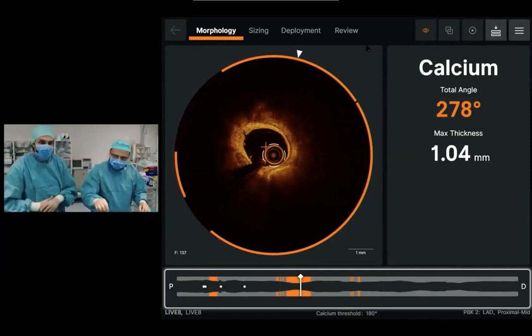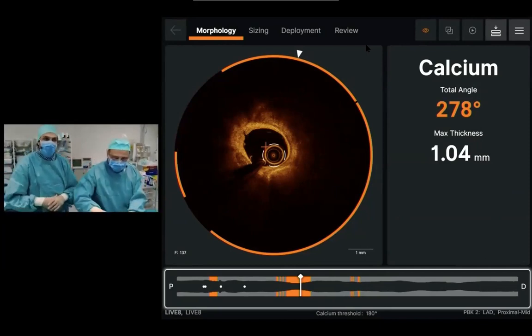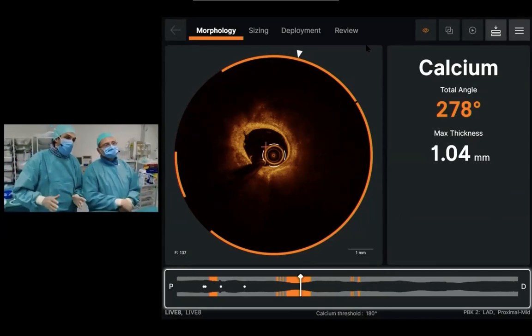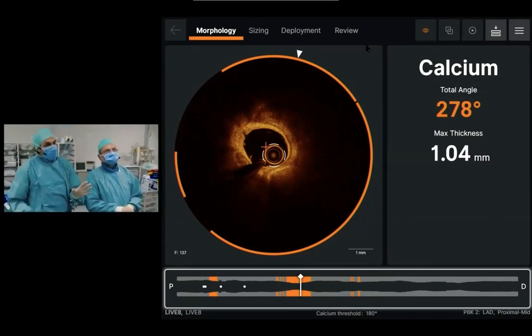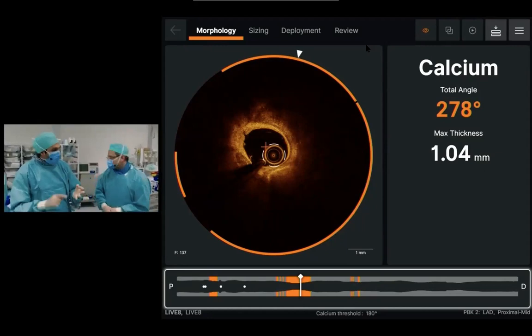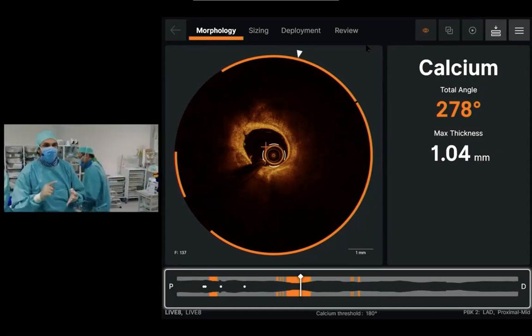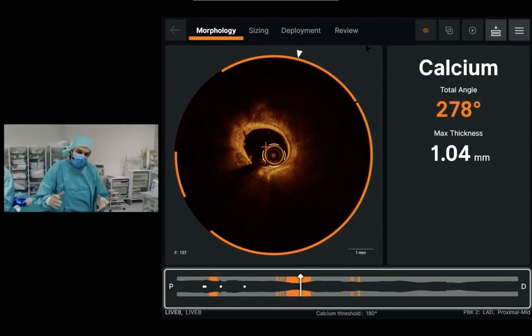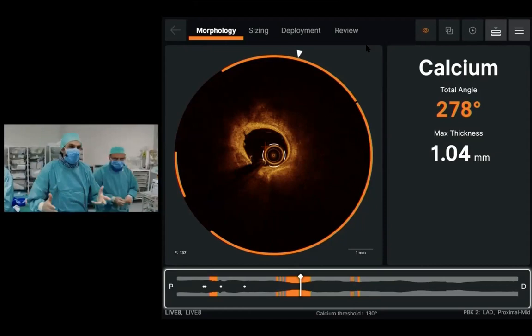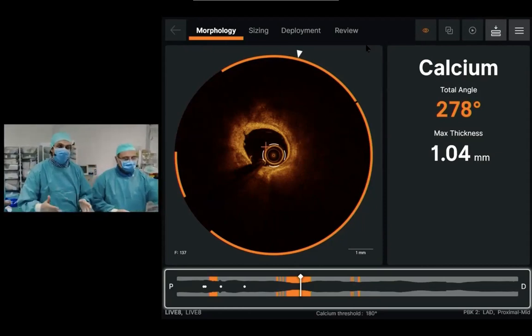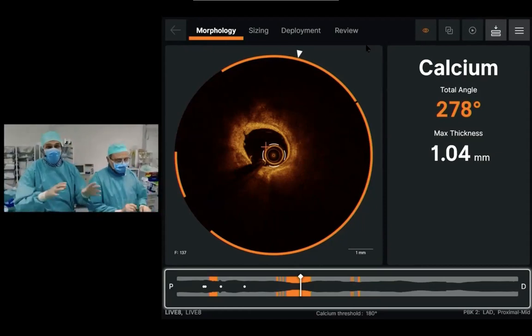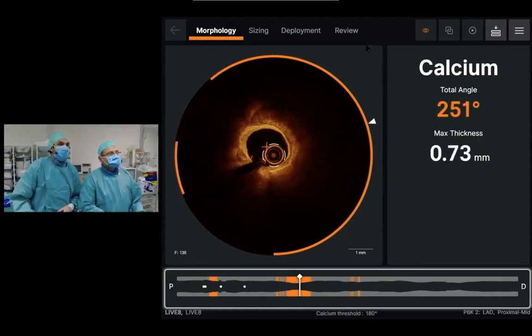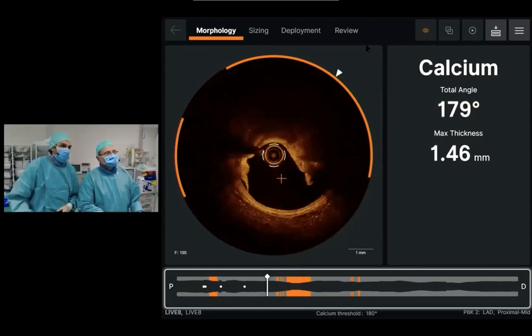These orange markers are telling you where the calcium is more than 180 degrees. When I look at calcium, there are three things I want to know: I want to know the arc, I want to know the thickness, and I want to know the length. These are the three things that can help us decide whether these patients need additional therapy, which in this case was already performed.